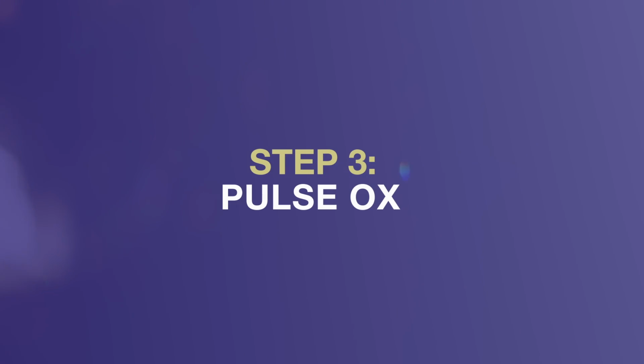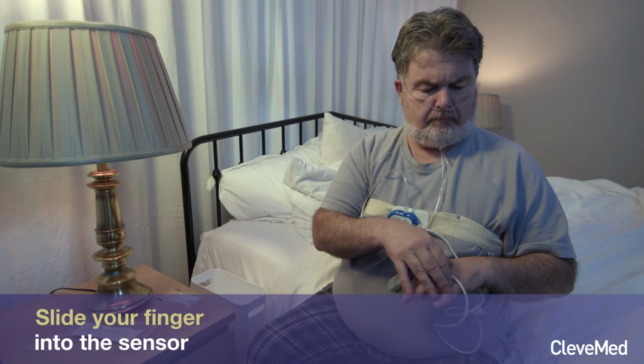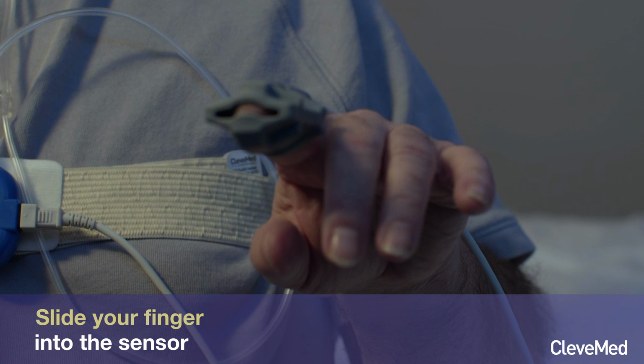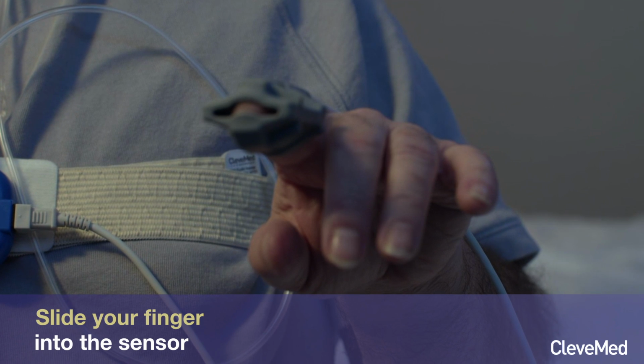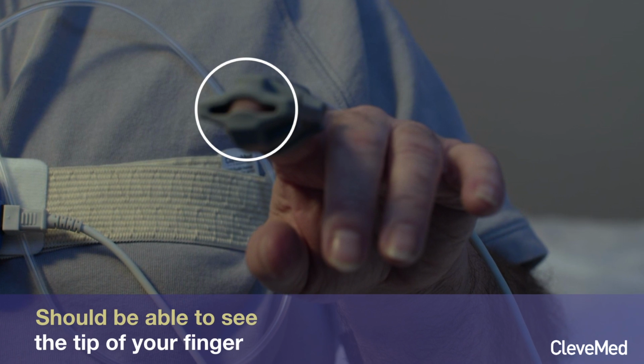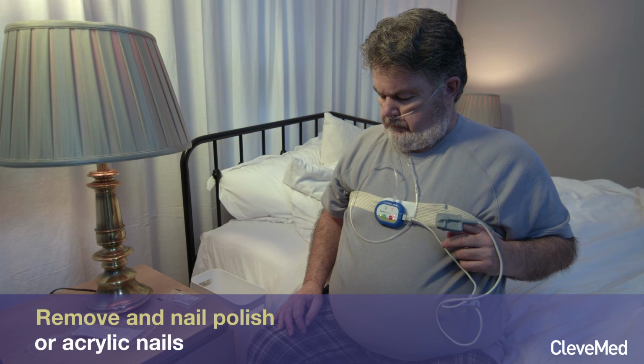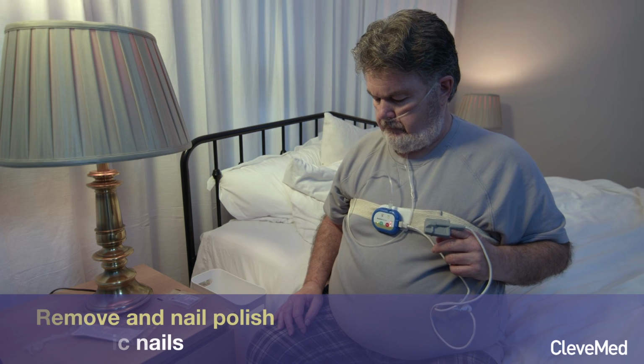Next, connect the pulse ox finger sensor to the SleepView Monitor. Slide your index finger from either hand into the sensor so that it covers your fingertip with the icon of a finger on your fingernail. You should be able to see the tip of your finger through the top of the pulse ox. Remove any nail polish or acrylic nails, as this can affect the recording.